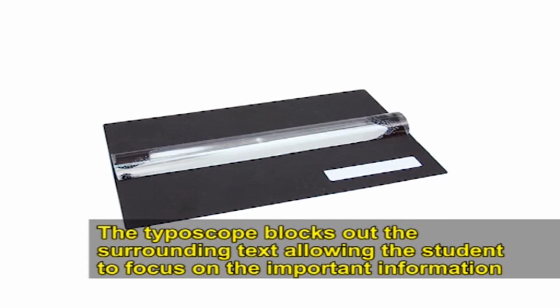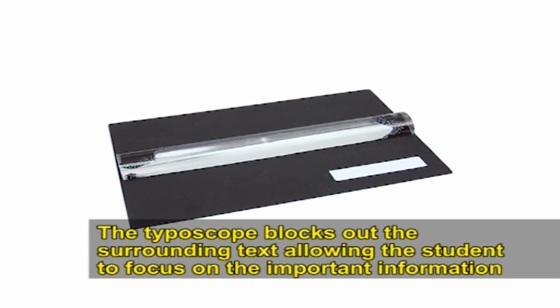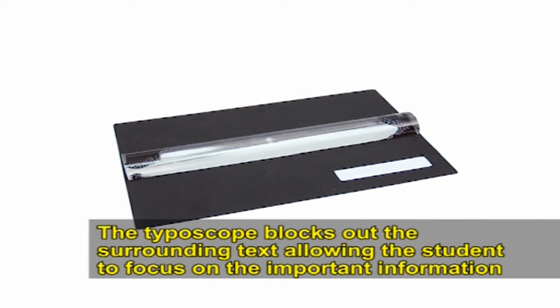Typoscope. A typoscope is a dark piece of matte cardboard with an oblong slot cut from the middle. When placed over text, the typoscope frames a visible section, eliminating glare from the surrounding white space. The cardboard is slid across the text to read it. It may be especially helpful to students who find it difficult to focus on a word or track a line of print. The typoscope blocks out the surrounding text, allowing the student to focus on the important information.